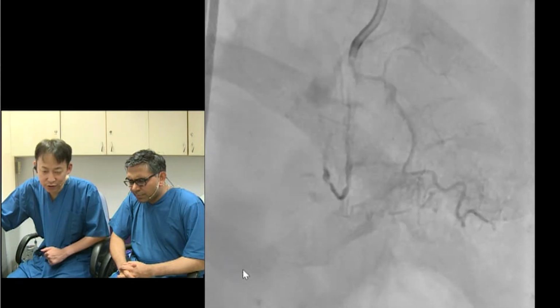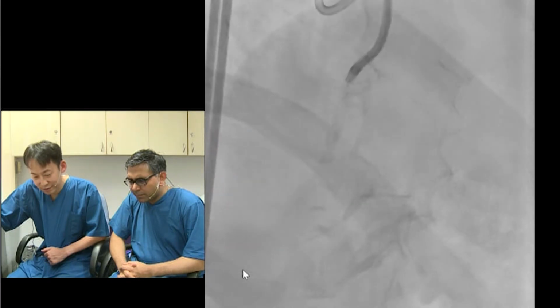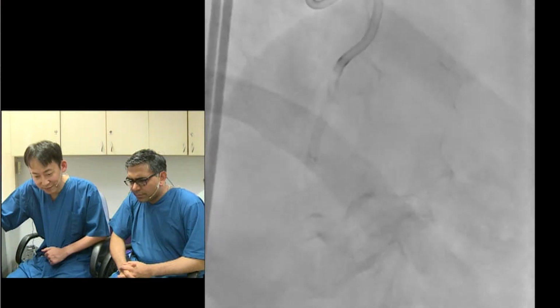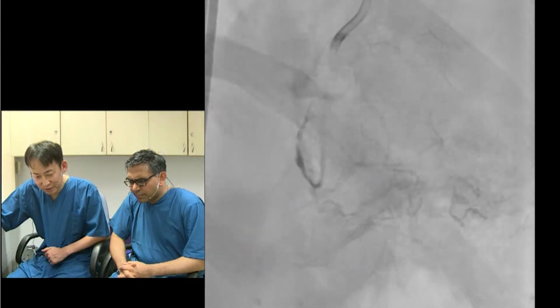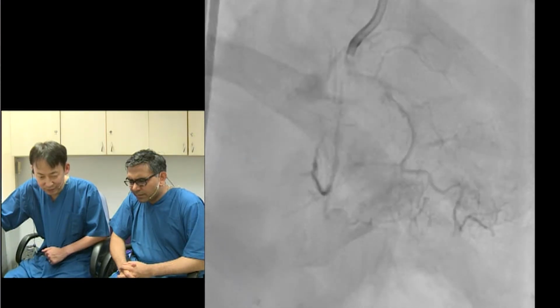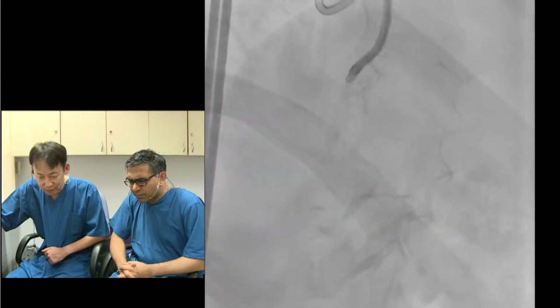So could you discuss the strategy about this case? I think there is perhaps a microchannel. I might try first XT or XTR. If I'm lucky, maybe I can go through. And if it doesn't, then go to wire escalation, some Gaia 2 or things of that nature.